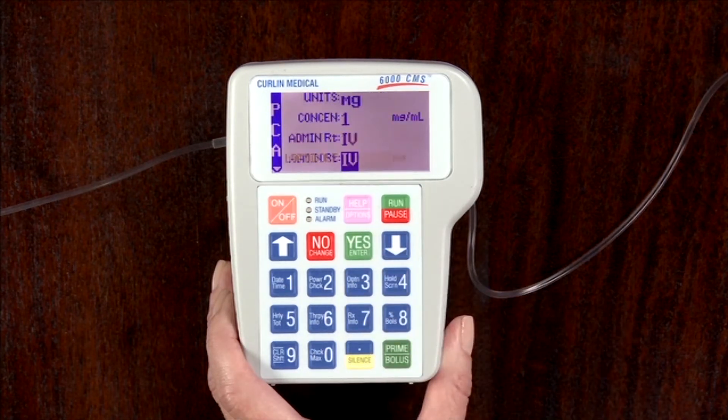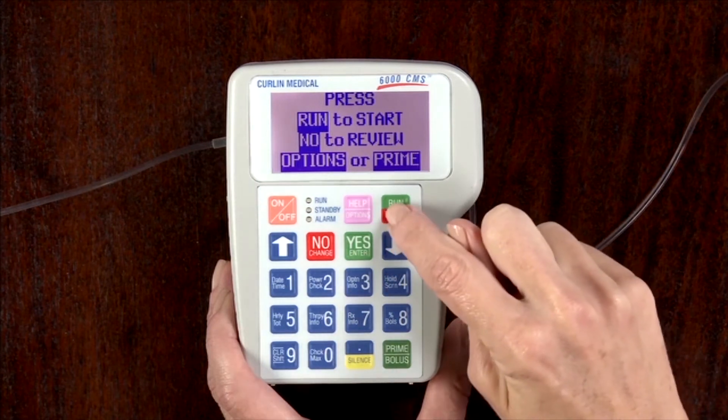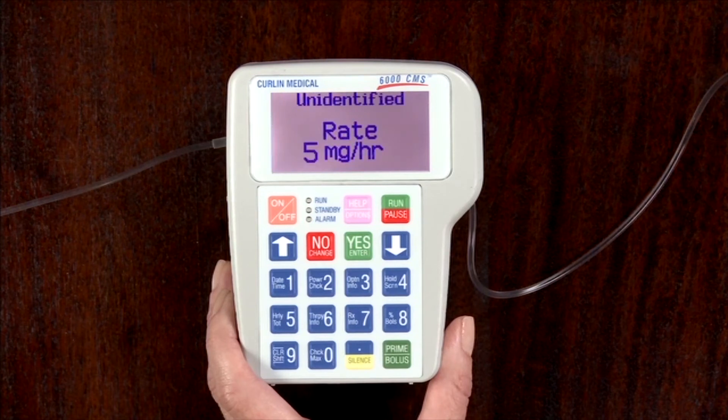The pump will scroll through the program and rest on the run to start screen. Now press the run key to restart the infusion. Information such as volume and time remaining as well as amount infused will be scrolling on the screen and pertain to the new bag hung.